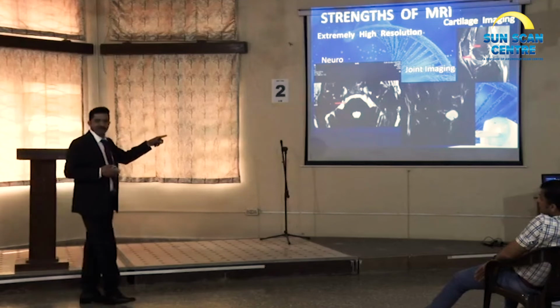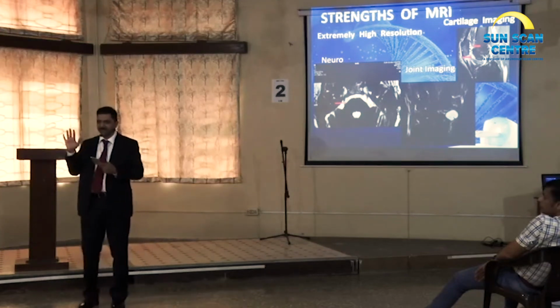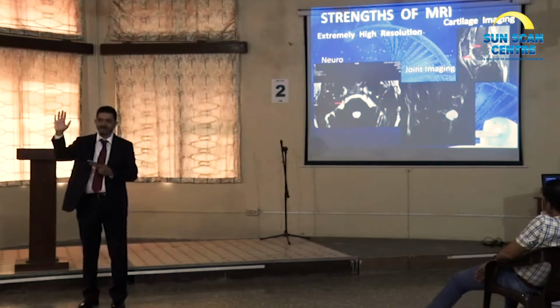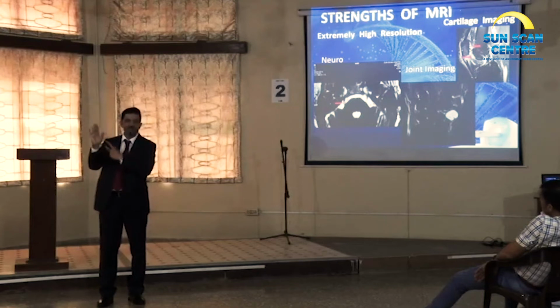You have the middle image. Well, it's not projecting very well, but it's an image of the wrist. So it's an image taken like this, because we want to see the thin, the small bones here.